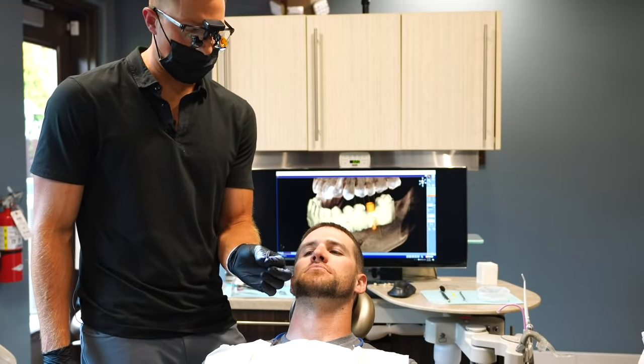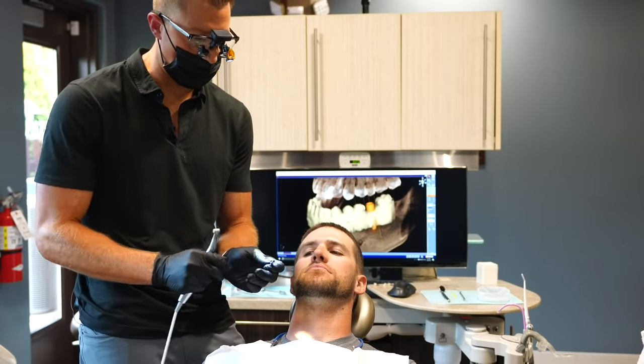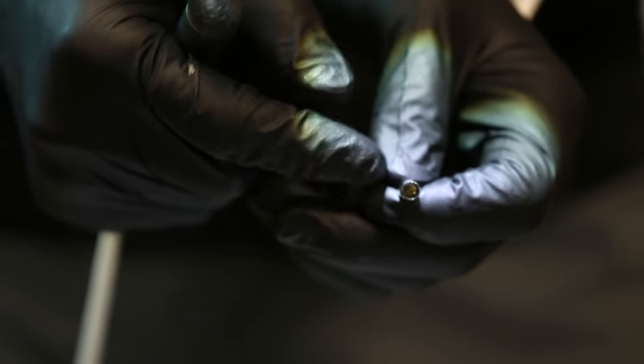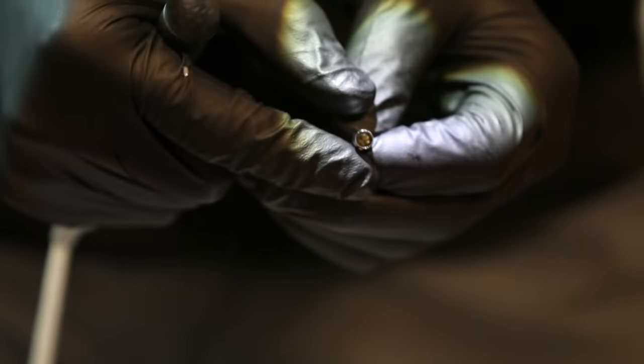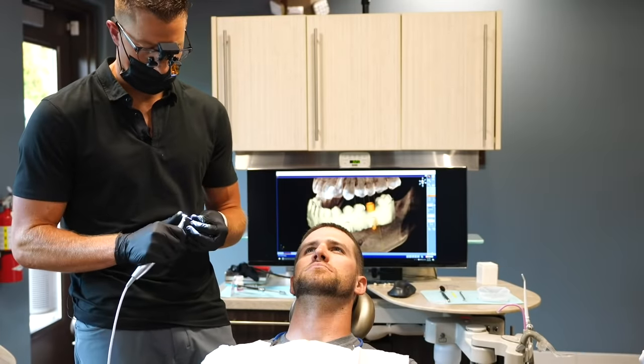So rather than using a blade to cut an incision that is going to have to be reflected off of the bone, this is our blade. It's a little tissue window. This is going to put a little dot on his gums where we can remove just that small portion of tissue. If you ask me, would you rather have an incision and sutures and all that process, or would you rather have that little hole placed in your gums and the implant goes through it, you can see why it's much more comfortable post-op, less infection, safer for the patient, less pain, and it's quick. So all that's benefit.